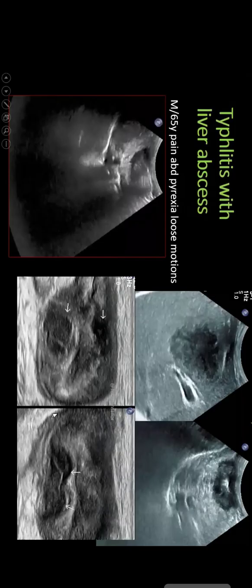So yesterday I told that I will show you one case. So this was drained, and this was a typical case of amoebic colitis or amoebic typhlitis. And these are large amoebic abscesses in the wall of the cecum and an associated abscess in the liver. Single large abscess, amoebic typhlitis, cecal wall abscesses.